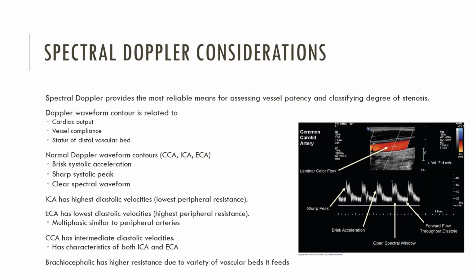Okay, I did mention how you obtain your spectral Dopplers. We have to pay great attention to following all of the appropriate practices in this. So just a quick review, some people struggle with this. Most likely you guys have been scanning for some time and won't have any issues, but we want to look at this. You see the color box is steered. When that color box is steered, it automatically is going to steer the spectral box with it, or the spectral sample with it.